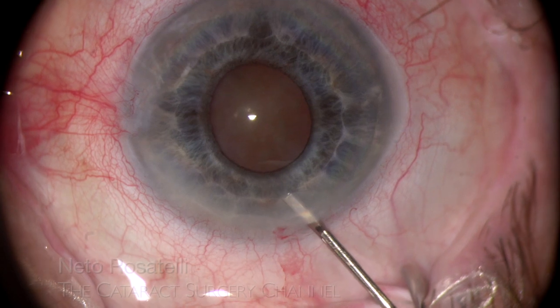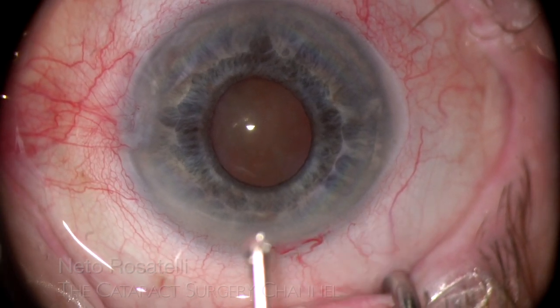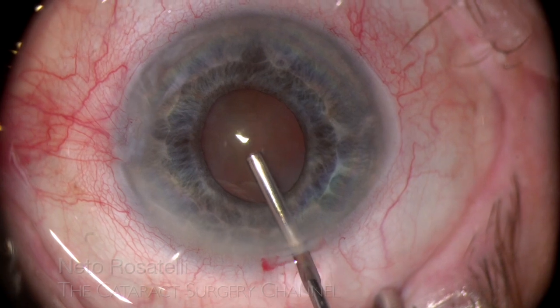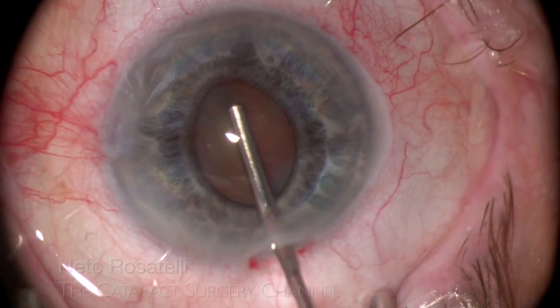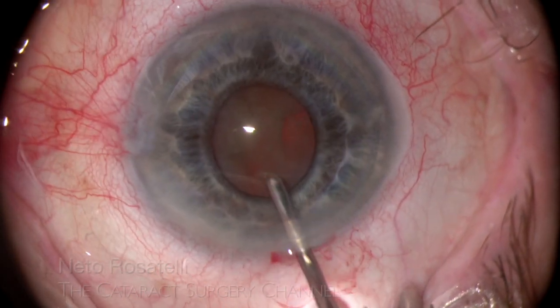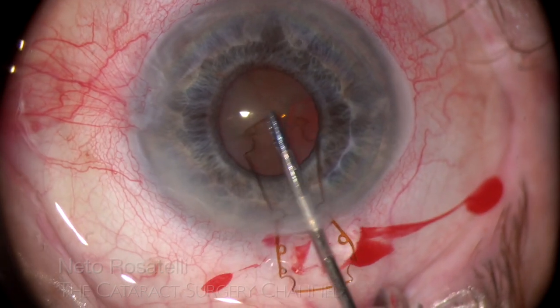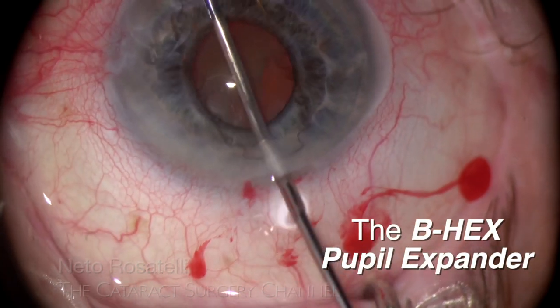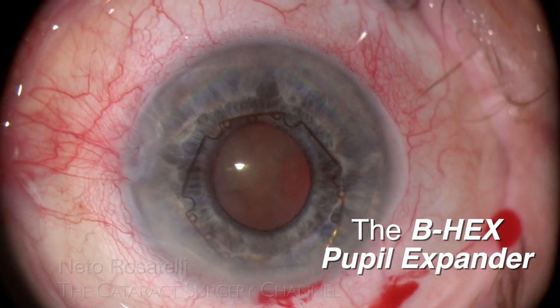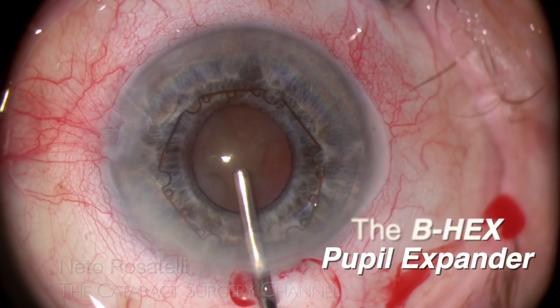We can see that it is a very small pupil and a fairly dense nucleus, and as I decided to try phacoemulsification to preserve the advantage of a small incision, a pupil expansion device is the smart choice and I go for the B-hex in this case. The B-hex is very thin and flexible, needing no inserting devices or injectors, being able to be inserted in the anterior chamber in one smooth movement using a 23-gauge forceps through incisions as small as 1.5mm.